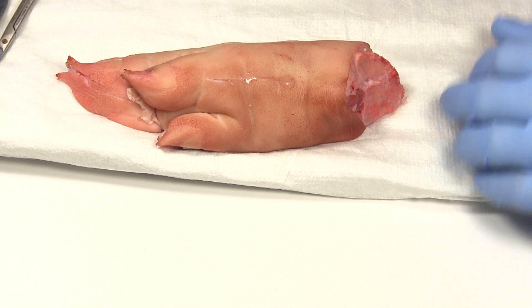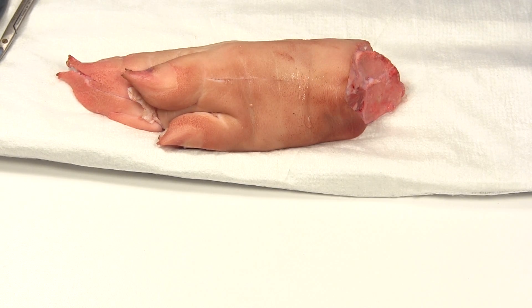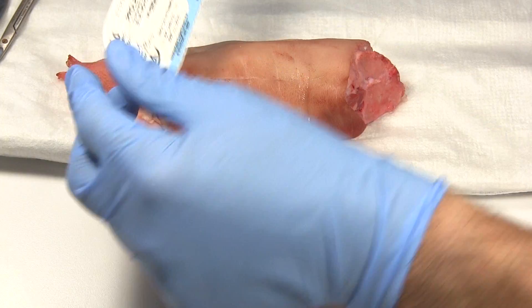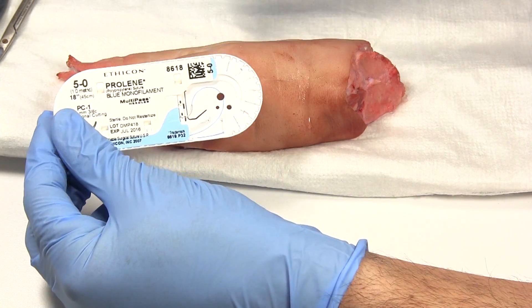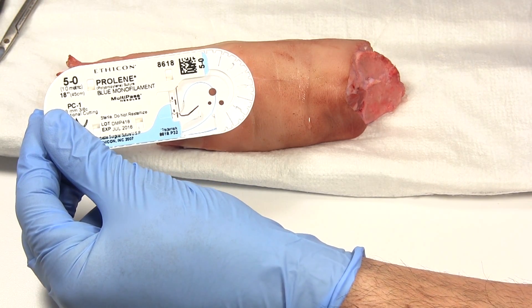Now for sewing — the type of thread will obviously depend on the body part. Today we're going to use some 5-0 prolene, so for this I will generally use the small needle driver.